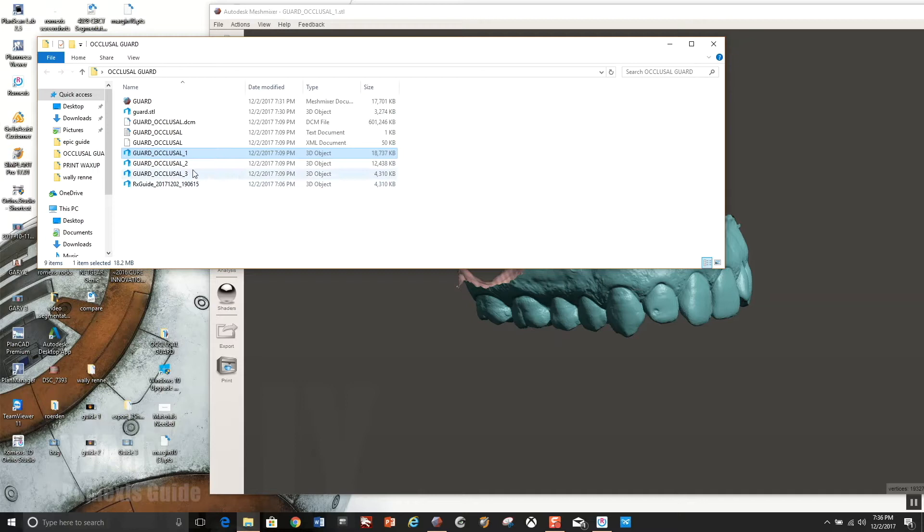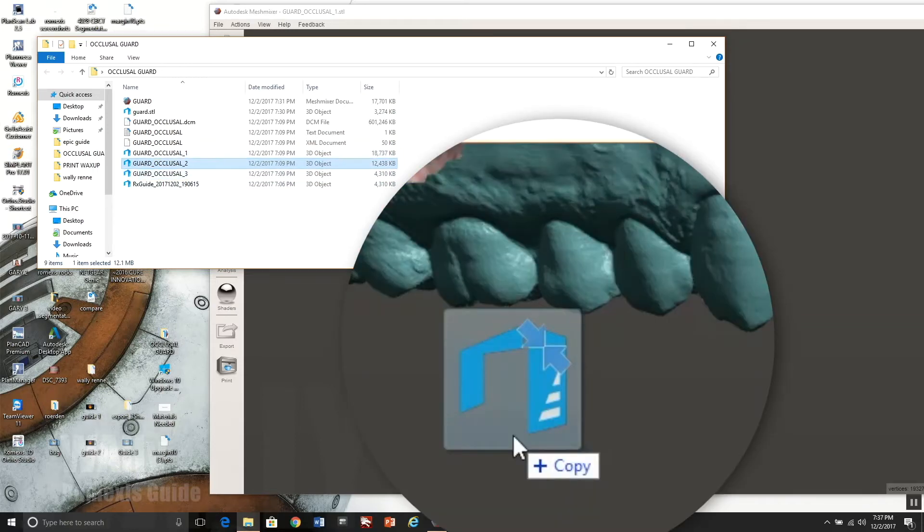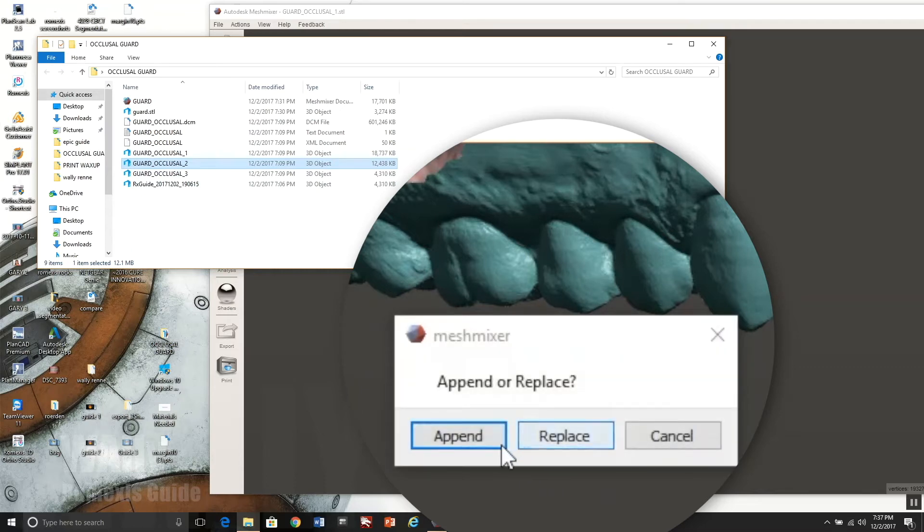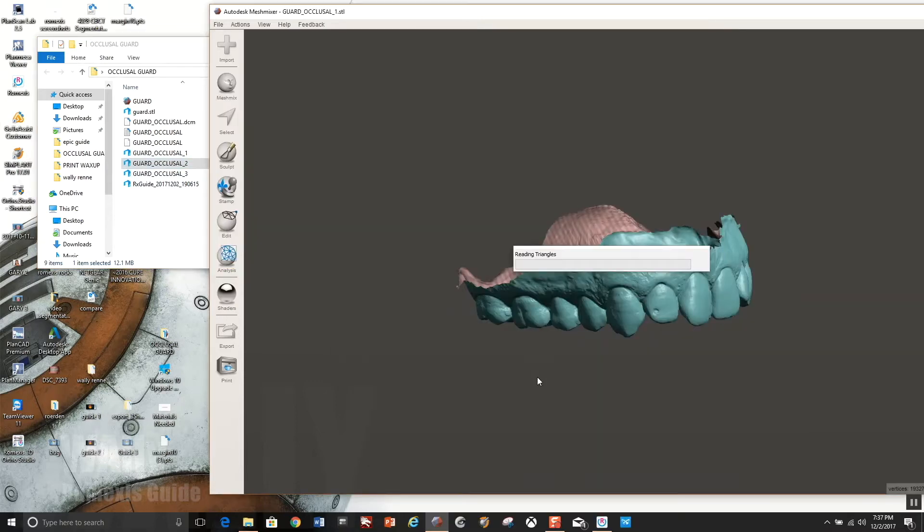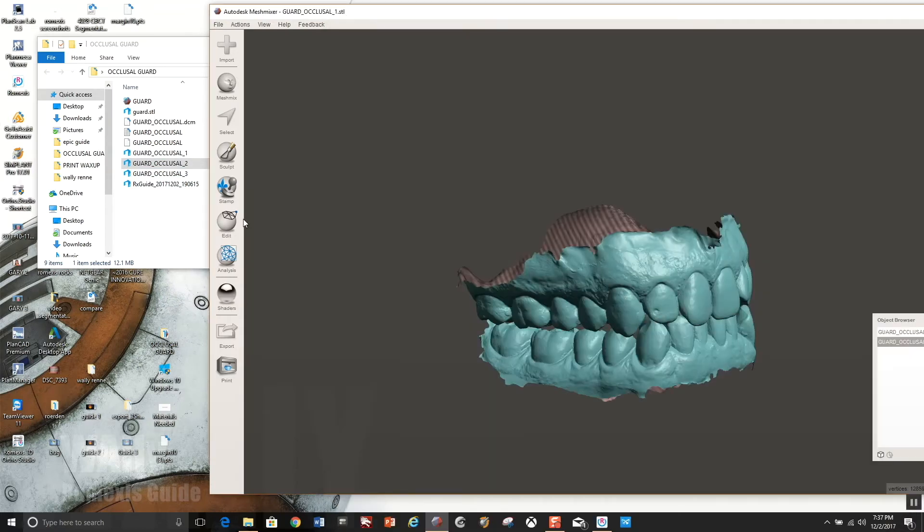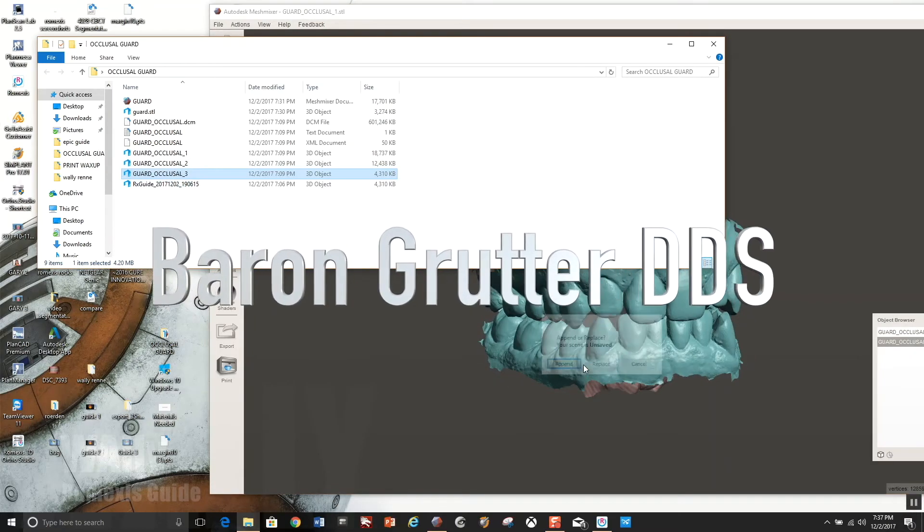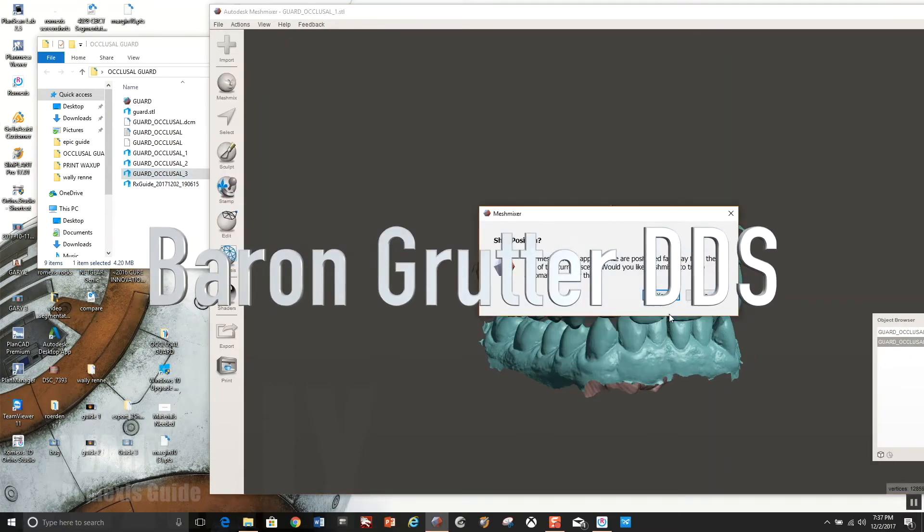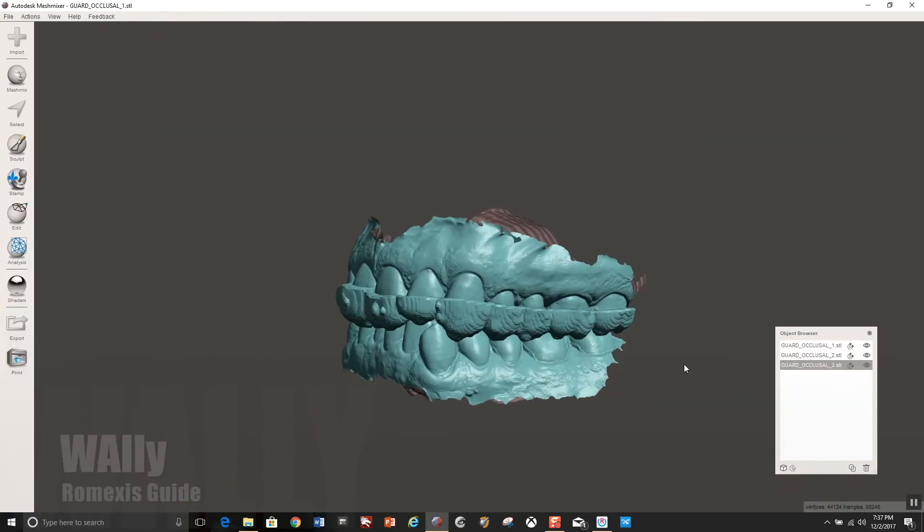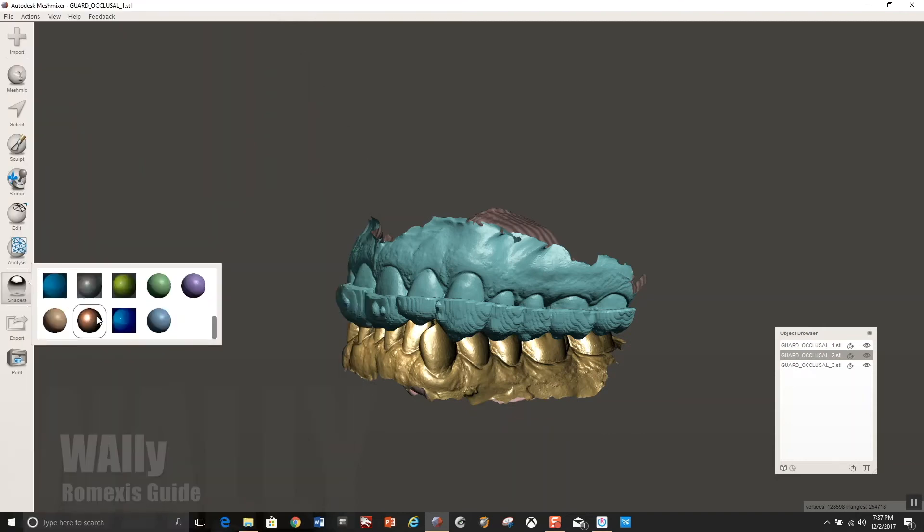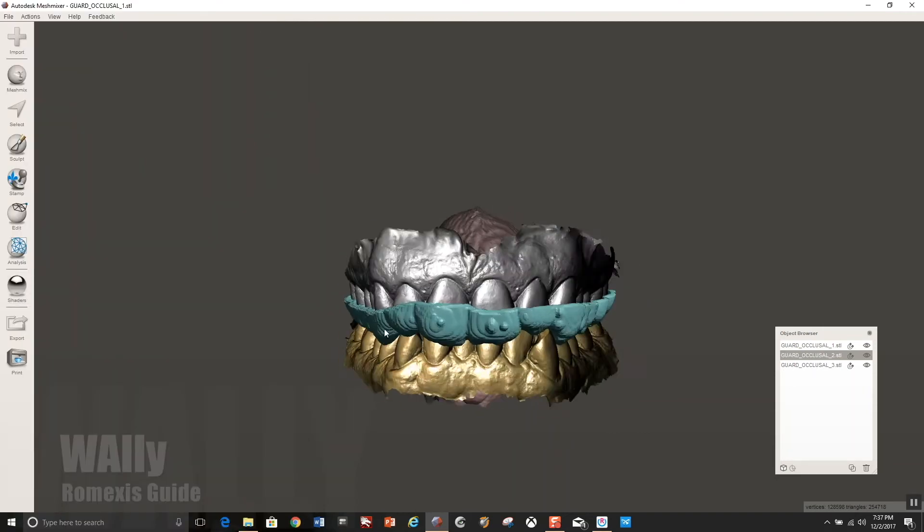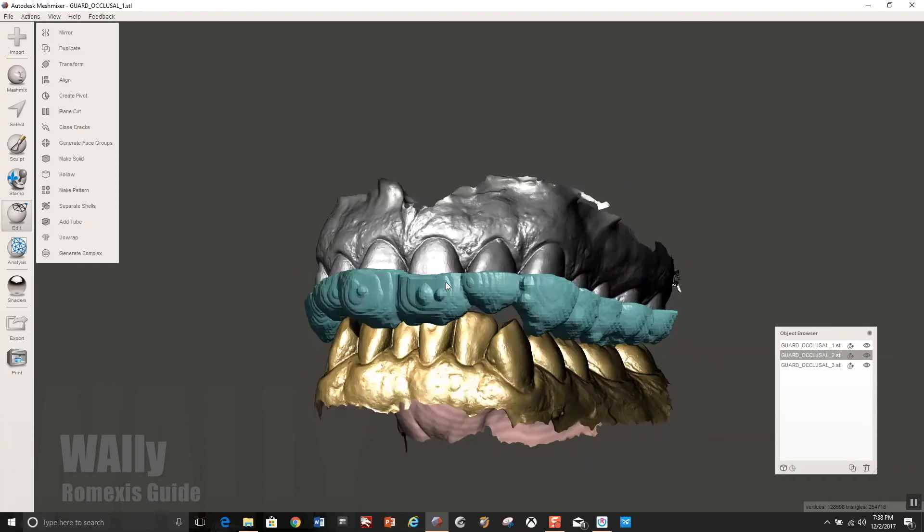So now you go into Mesh Mixer and you will import those STL files that you just exported. And you will append the new files to one another. So there should be three files, maxillary mandibular and then the guide. And then hit no when it says the files are positioned away because it really doesn't know what it's talking about. This guide technique was from Dr. Gutter. That is kind of a loose adaptation of what he does.